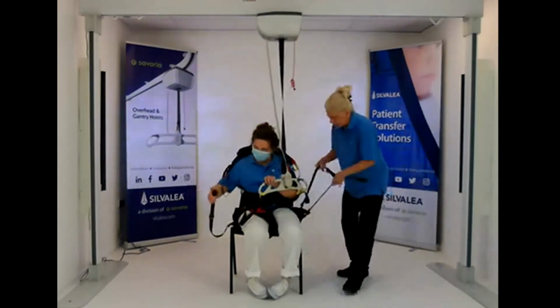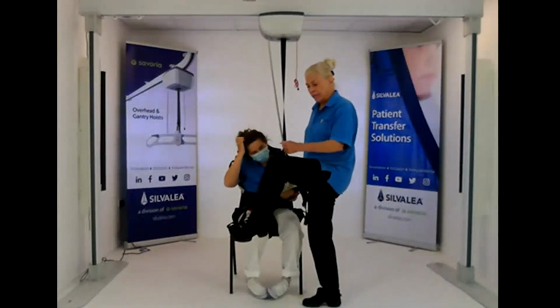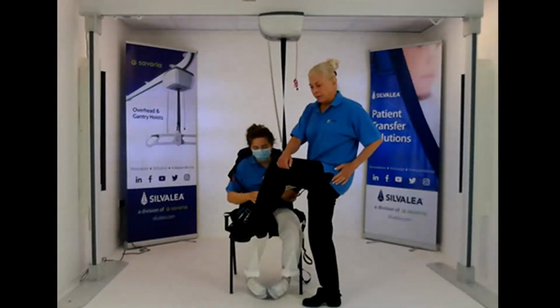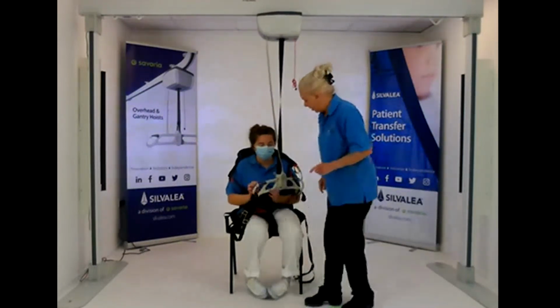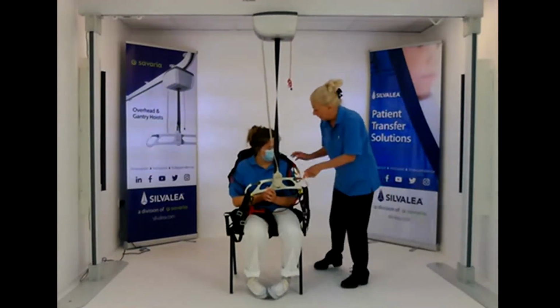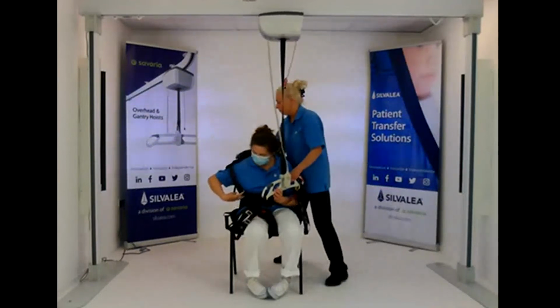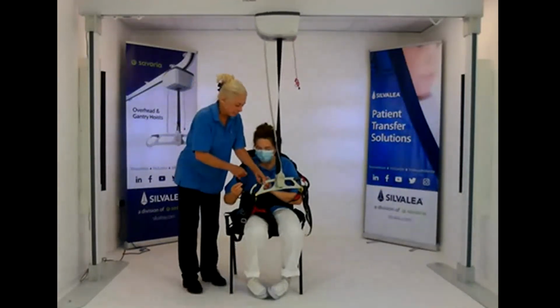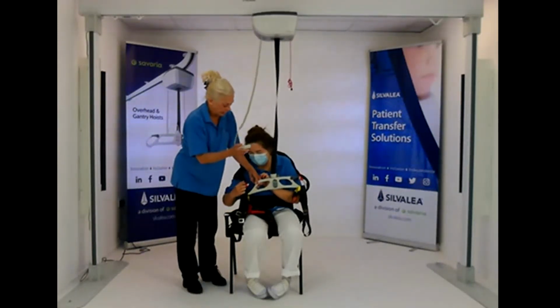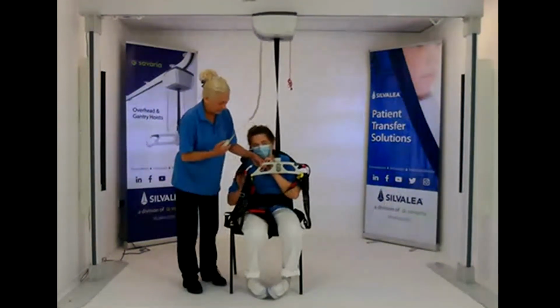The two sets of hip tapes, now with these, we need to maybe adjust so that the lower one towards the knee is shorter than the higher one, so that you're keeping that flexed. So you may have to have slight adjustment there, but they're on the slider, so you can do that. Then we've got the shoulder. So you can see it's much easier to apply on a bed. And certainly with real active wrigglers, probably will need several carers.